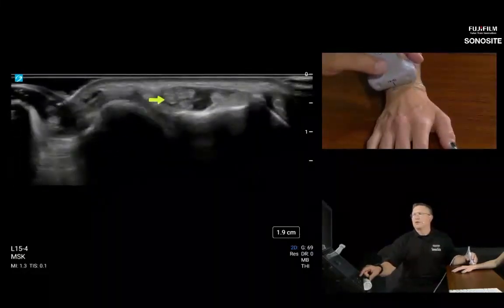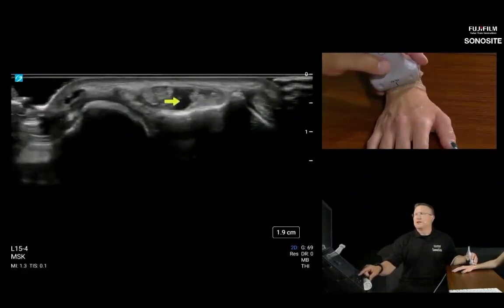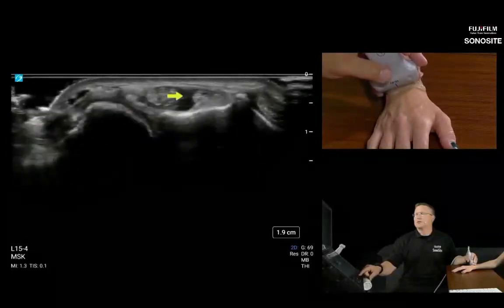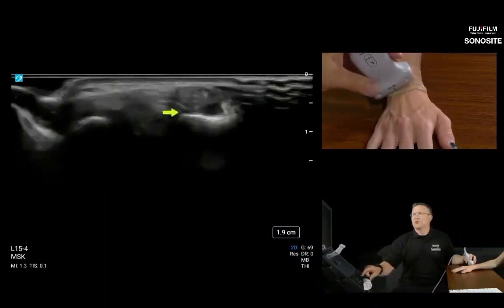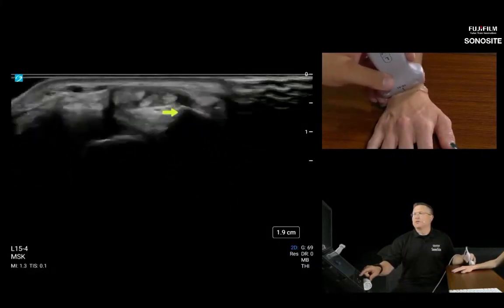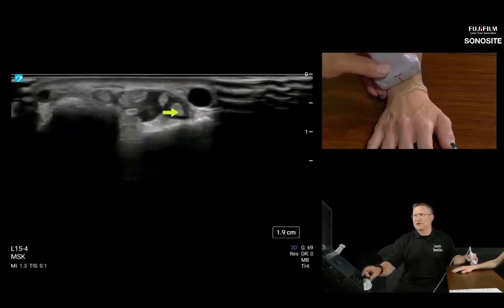And then here we are on the dorsal, the extensor digitorum and indicis proprius here. So wiggle the fingers. And this is what I mean by a gross anatomy survey. We're just looking for large joint effusions protruding into the dorsal wrist. We're looking for tenosynovitis and where it might originate, but not necessarily the little details of its cause.